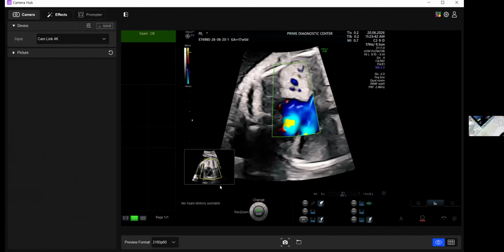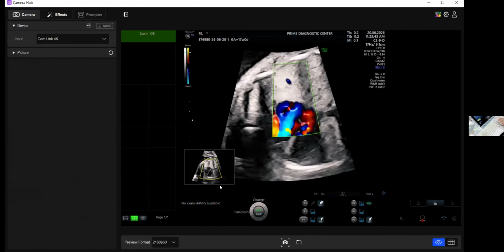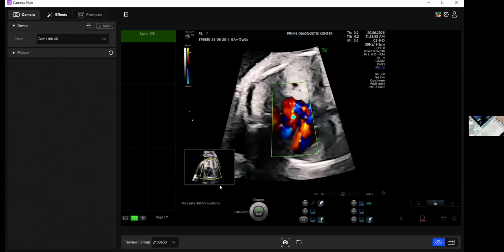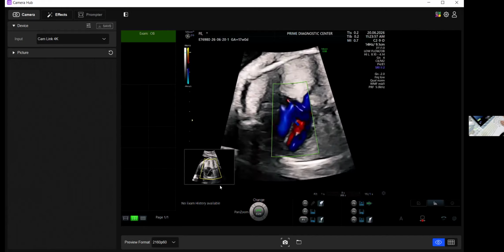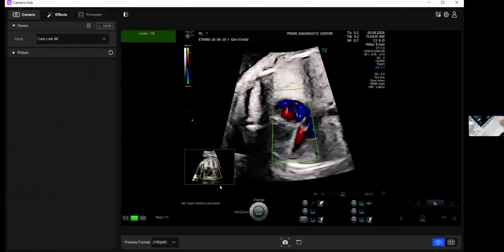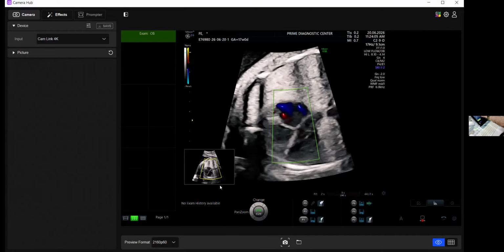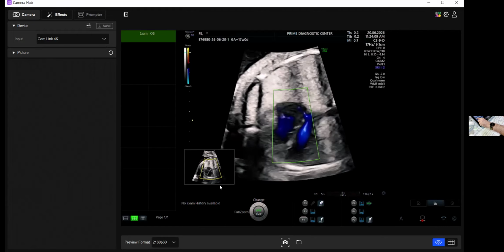And that's the right lower pulmonary vein, which is joining here, this one. Okay, so anyway, we are not focusing on pulmonary veins right now. So let us increase the, so there we are. Then we have this, okay, and I think there is a bit more of smoothness. I'm going to reduce that.